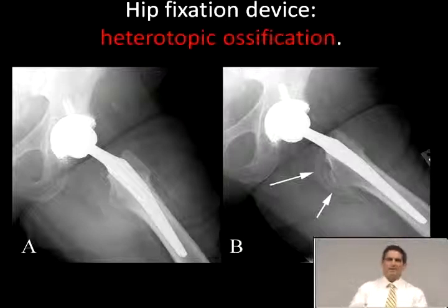So, prostheses in general, plain film examination first. MR and CT can be done. It's problematic because there's artifact created by the prosthesis itself. So that gets dicey.